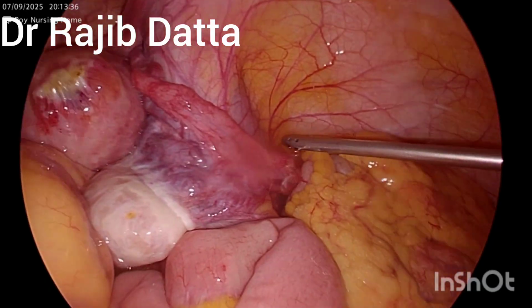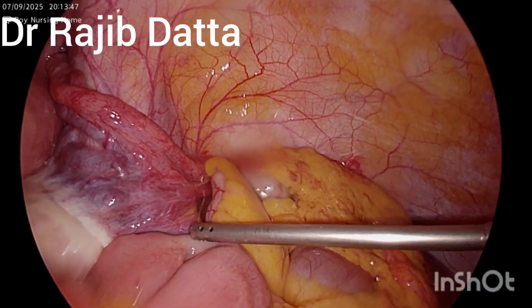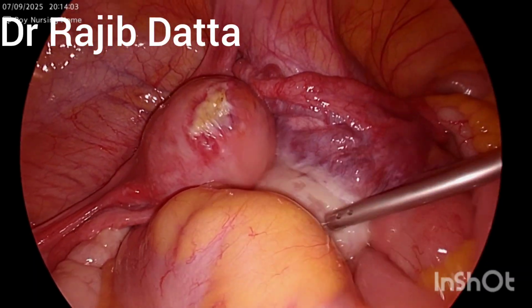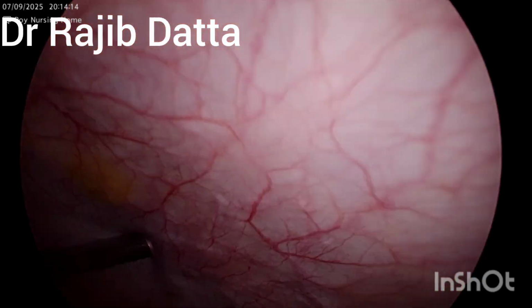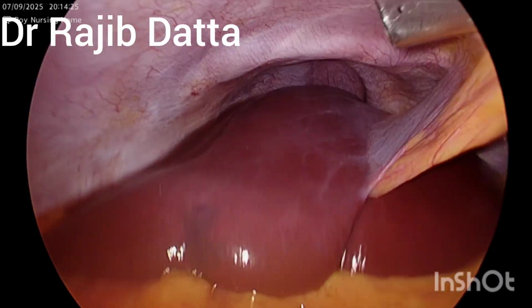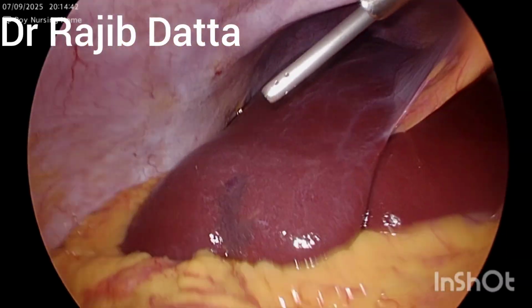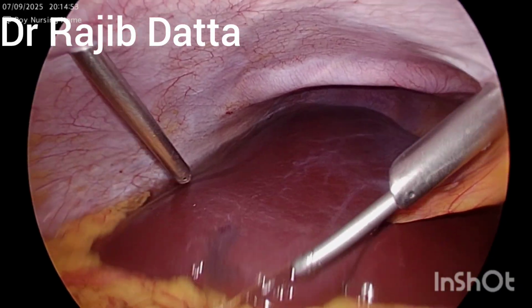So you can well appreciate, you can see the appendix here. The appendix is quite normal. On the left side also there is a large ovary, and right sided large ovary, and apart from this there are no other adhesions present. So our job is next focused towards the suctioning and irrigation. That is the most important part after operative intervention, because without proper suction irrigation the operation will not be complete enough.